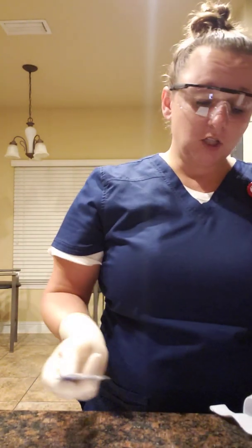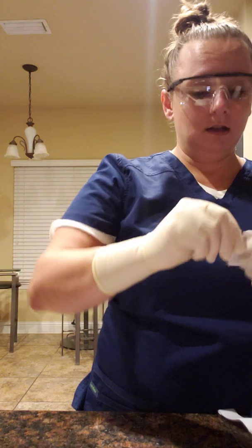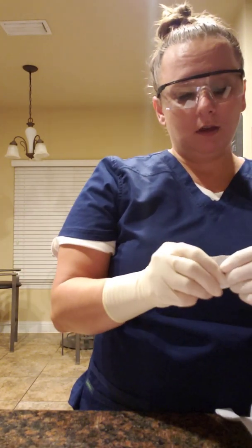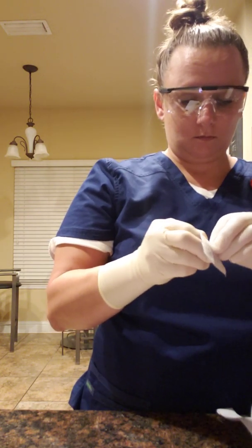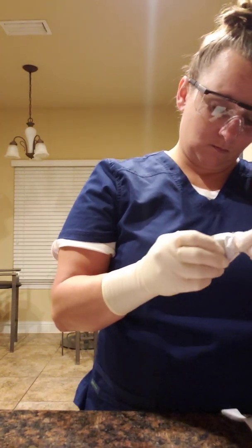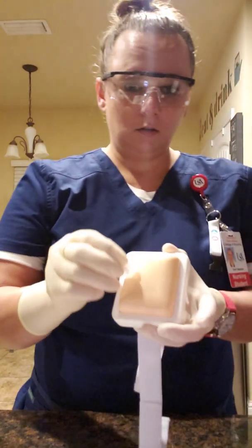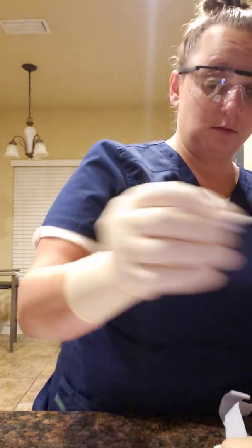Since this is an IM injection, I would give it in the dorsogluteal, and I would start by wiping with an alcohol swab, in circular motions from the center outward, being sure not to wipe the same spot twice.